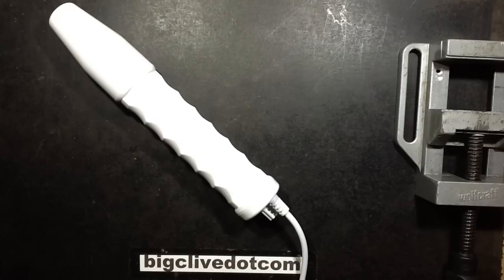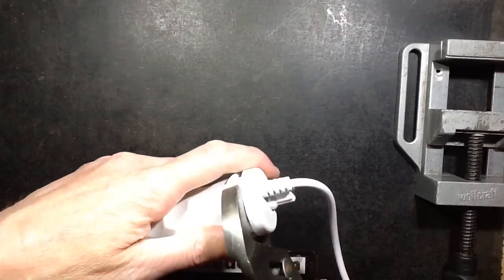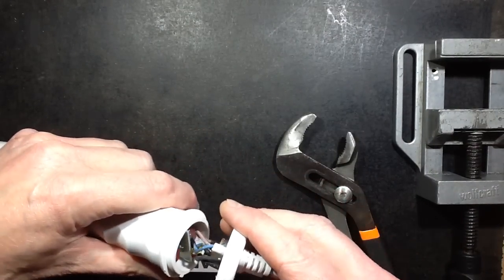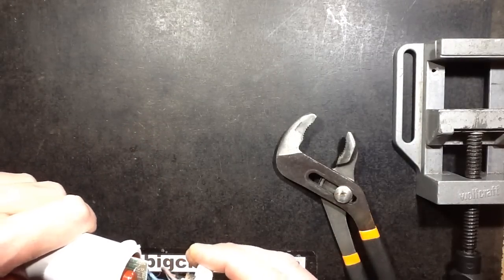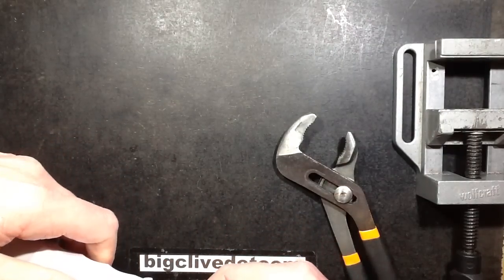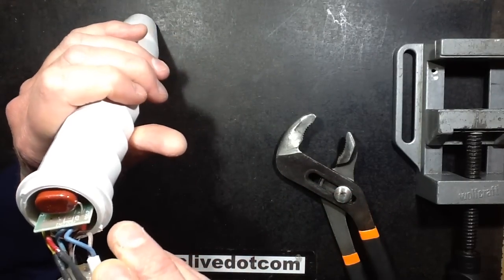Pipe grips. These should help somewhat. Oh, there we go. Okay, it kind of bayonet caps off. Here's a circuit board, but this is not going to come out. So the mains is switched through that, and then there's a couple of other extra connections.